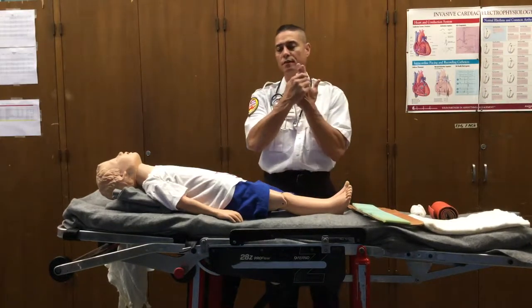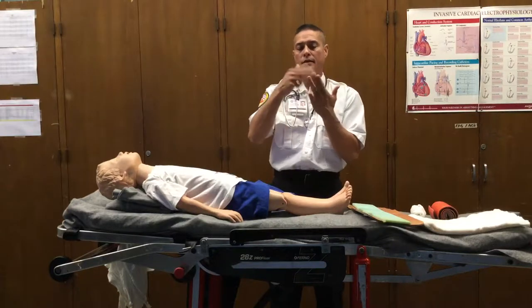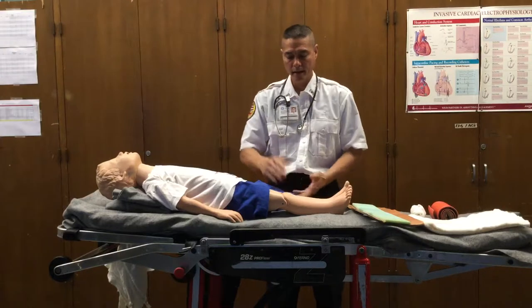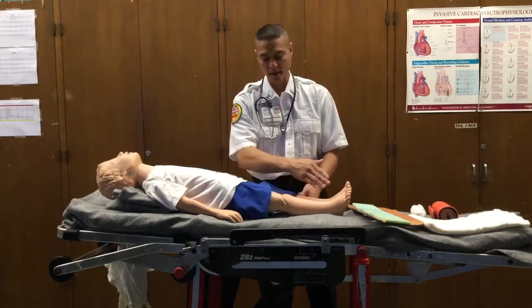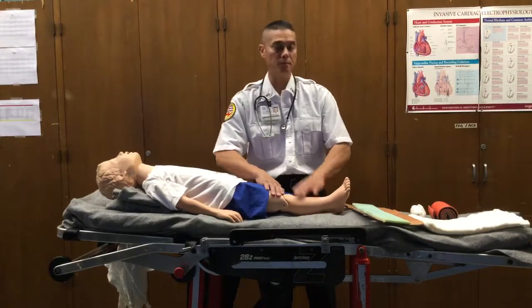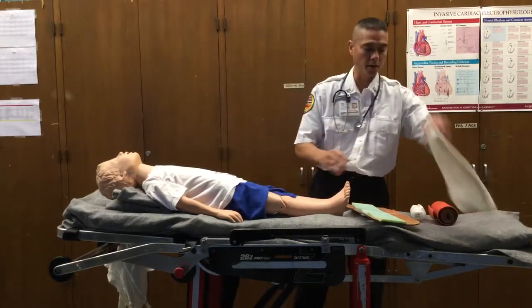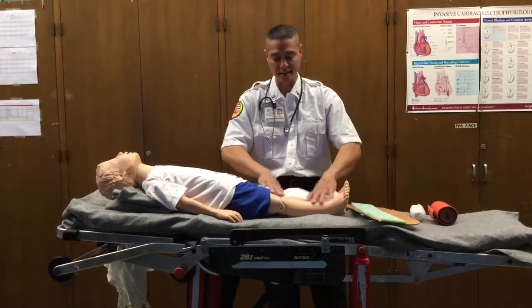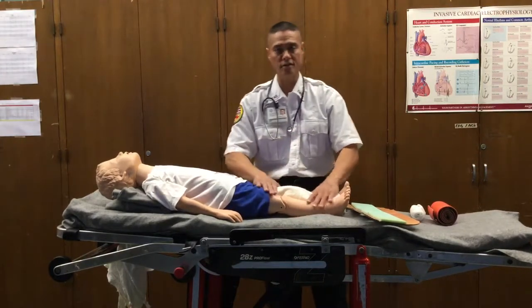Body splinting is like splinting your fingers together. The injured finger is splinted to the good fingers, and this keeps it all aligned. For a pediatric patient, if there was an injury somewhere along the thigh or the lower extremity, we can splint the good leg to the bad leg, but in order to do so we would have to pad the voided spaces — between the legs and in the groin — then go ahead and secure this.